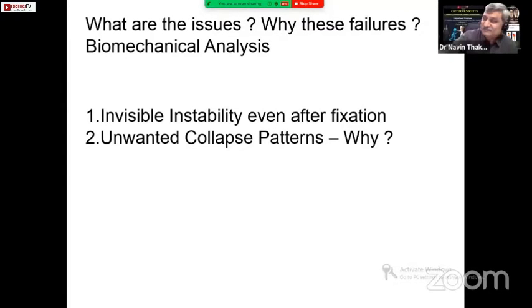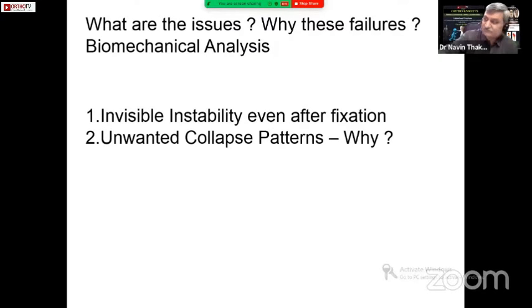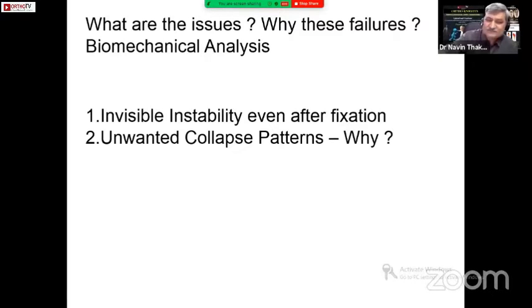But if I go one step forward, even if the LT is avulsed out, do we do anything for the LT, ever, if it is required? We do nothing for the LT. And in this case, that's not the issue at all. It may be two different cases, but one day the LT is away and still it has collapsed. So LT away has nothing to do with it.